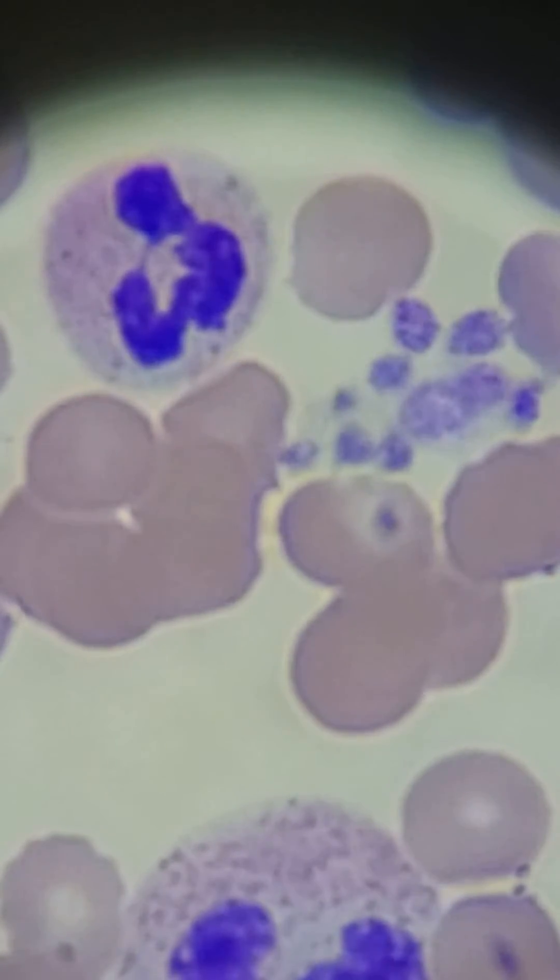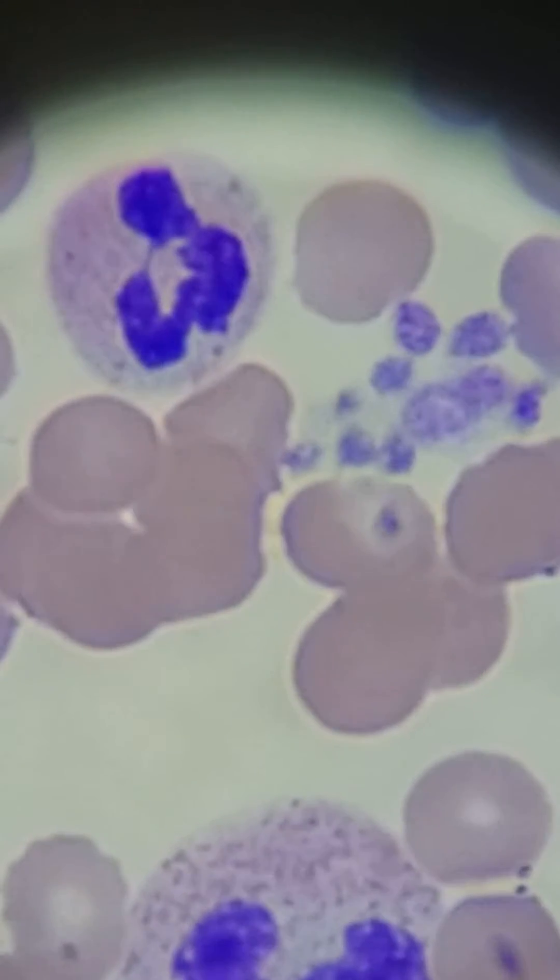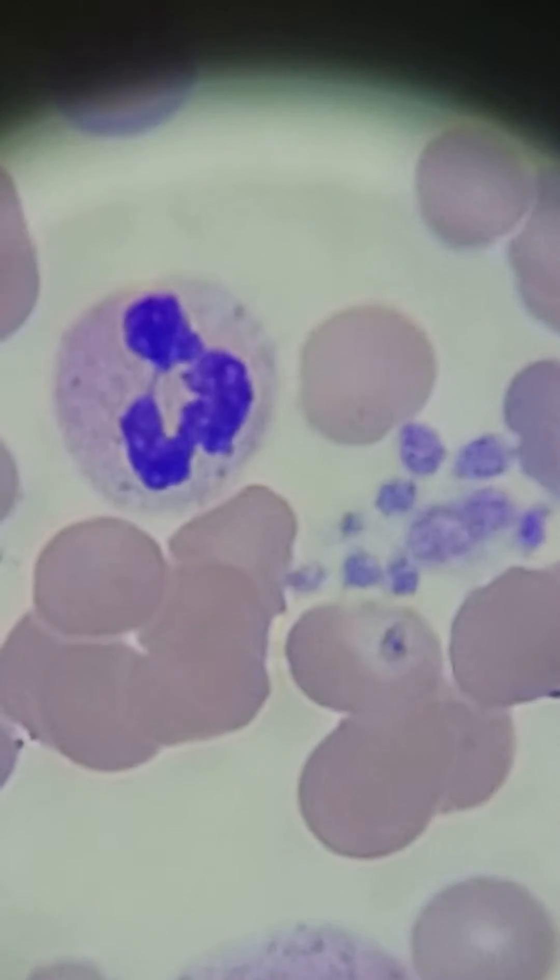Hi everyone, welcome back. This is really neat because we have a couple cool things going on here. We have a platelet clump right here to the right. Upper right, there's all these platelets.